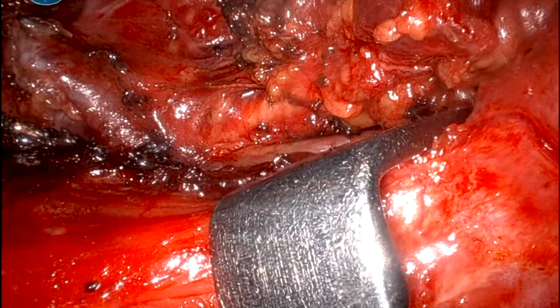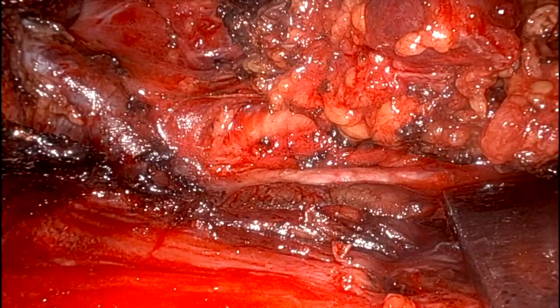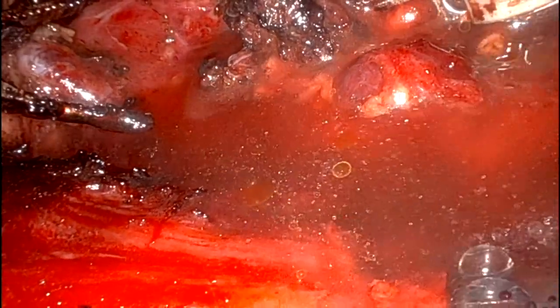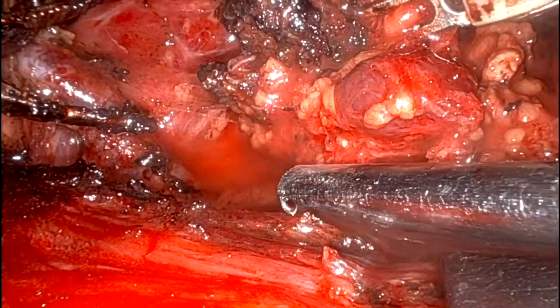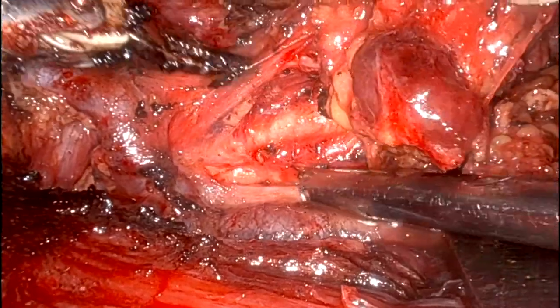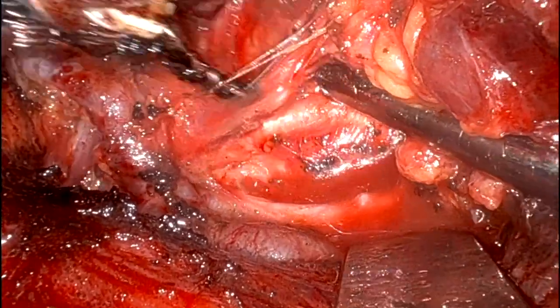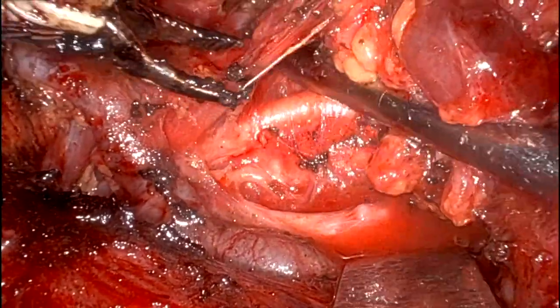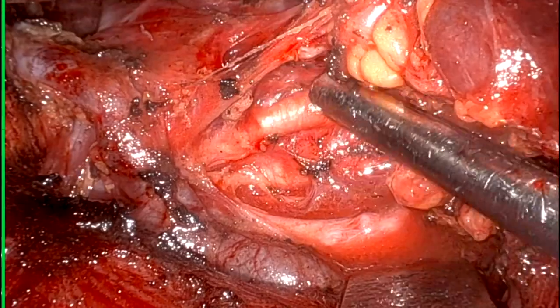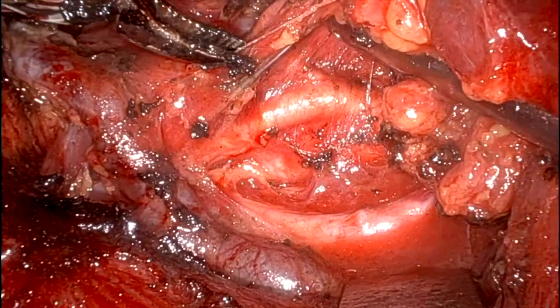Finally, I cleaned my camera. My assistant cleaned my camera. Now we have got better vision. And a wash. See the magic. Now, I'm sure you are clear that that is the vagus. Suction is just above carotid. Beautiful pulsations of carotid artery.